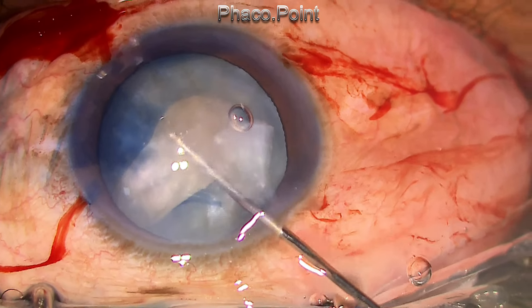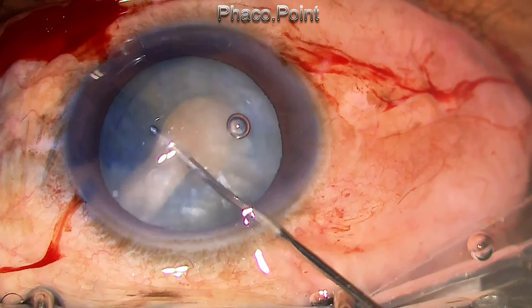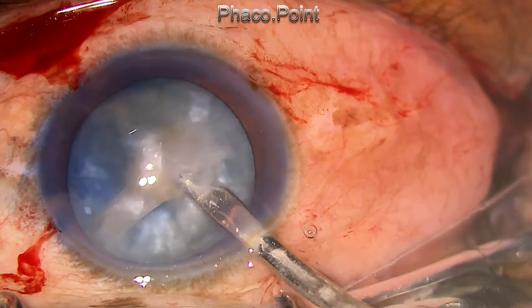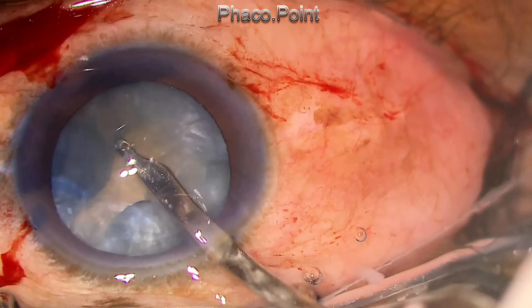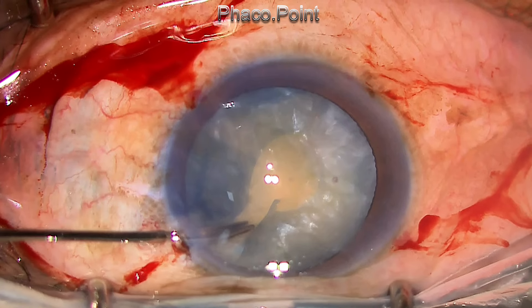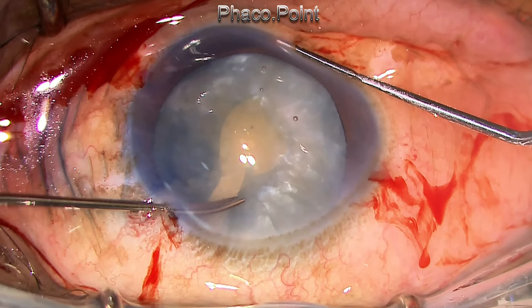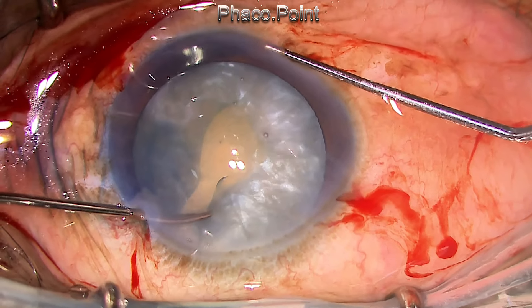You have to decompress all the cortex from within the capsular bag, and for this you have to use a Simcoe cannula as well as an irrigation cannula. I'm planning a small nick in the capsule through the side port using the intraocular scissors. The best laid plans can go awry — I find the scissors are so blunt they do not cut, and I just managed to crush the capsule at that point.